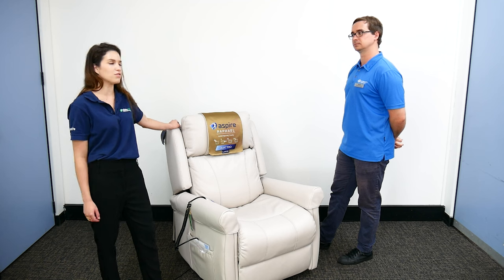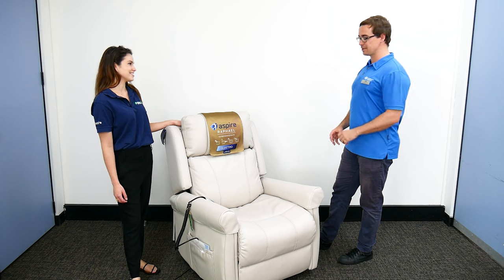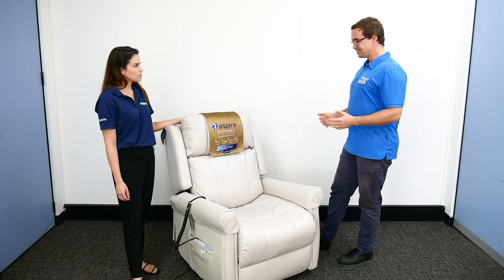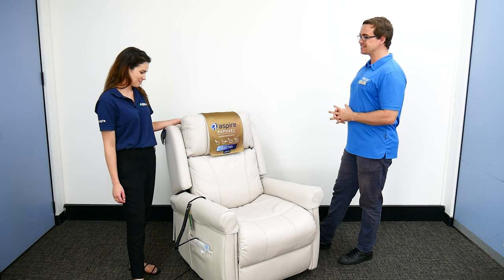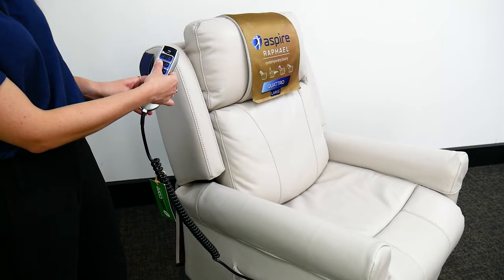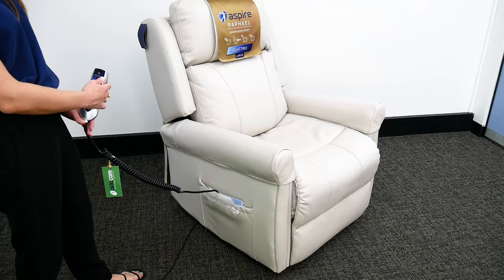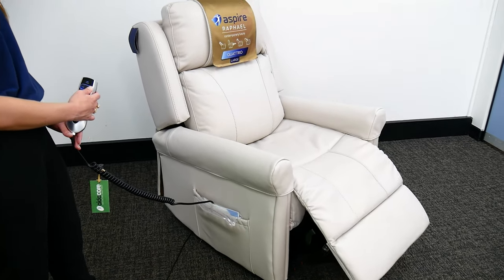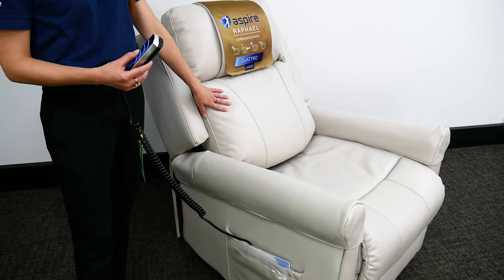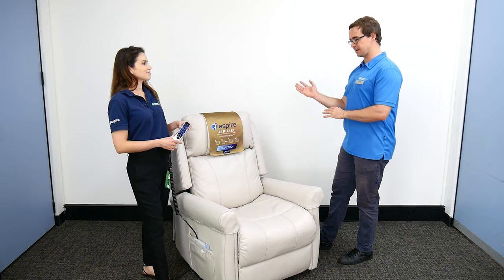Quattro meaning four — it's a four-motor chair. Recliners can come with all different numbers of motors driving how they move: some single, some double, but now we've got four motors in chairs. So what moves in this chair? We've got the backrest, the lift function, we can bring the leg rest up independently, and we've also got a head adjustment and a lumbar support.